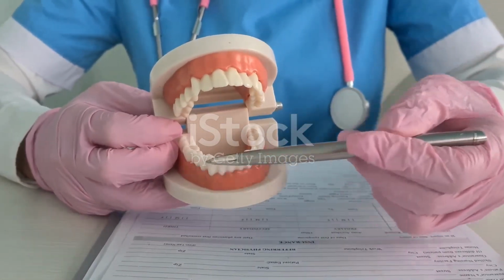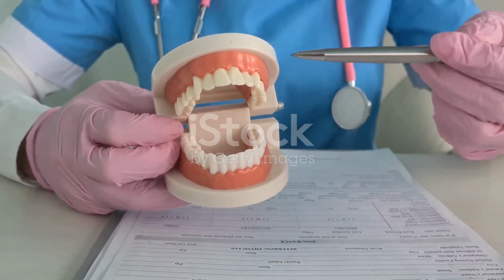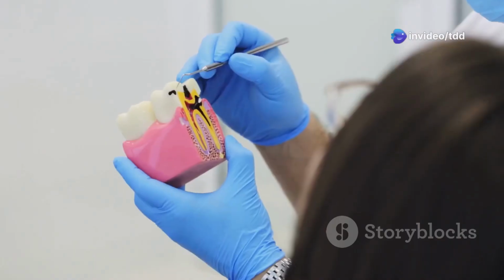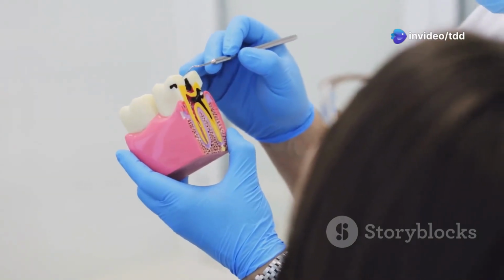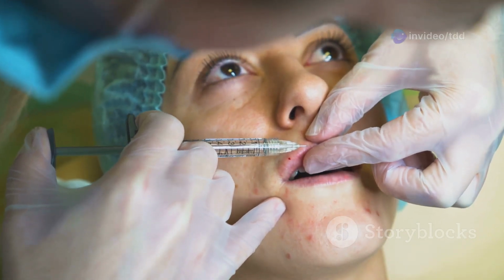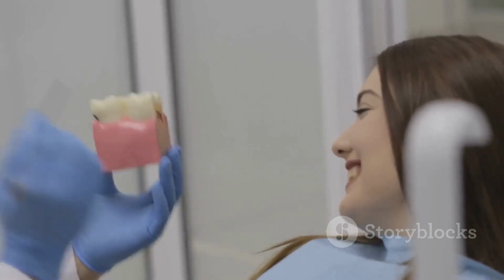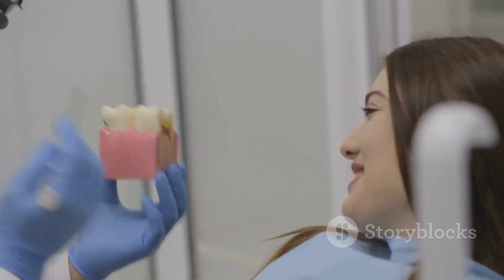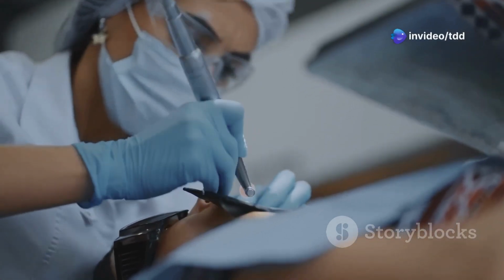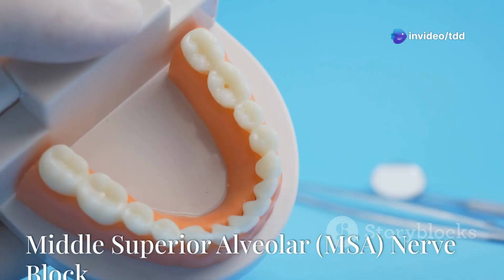The purpose of the posterior superior alveolar, or PSA nerve block, is to anesthetize the maxillary molars, except for the mesiobuccal root of the first molar. You should inject posterior and superior to the maxillary tuberosity. The landmark to look for is the height of the mucobuccal fold, distal to the second molar. This block is particularly useful for working on multiple molars at once.